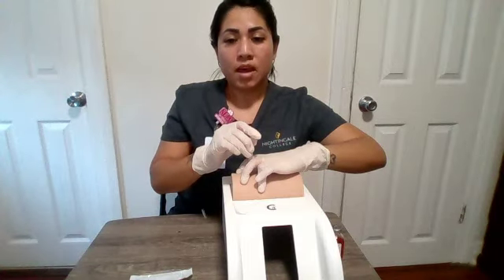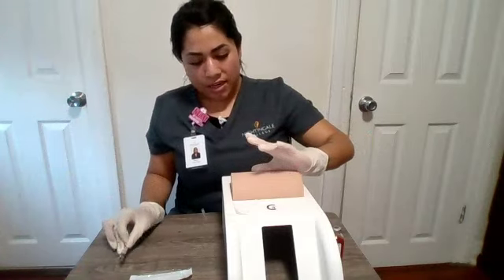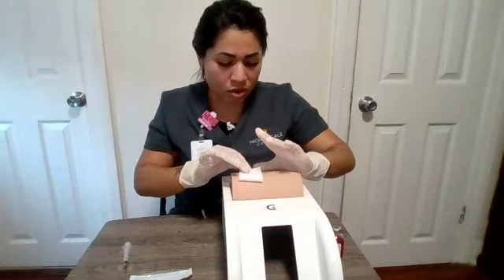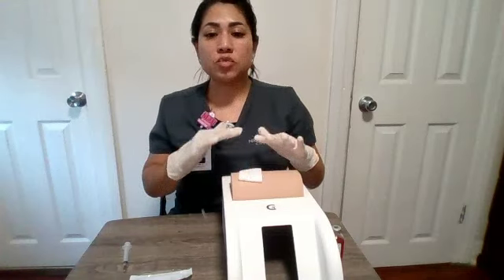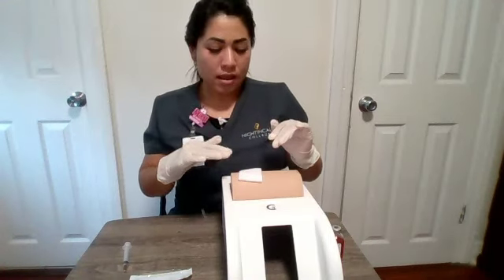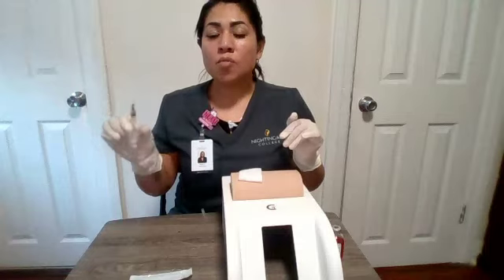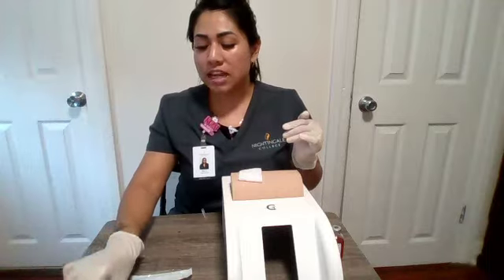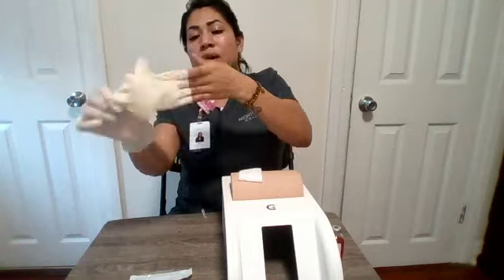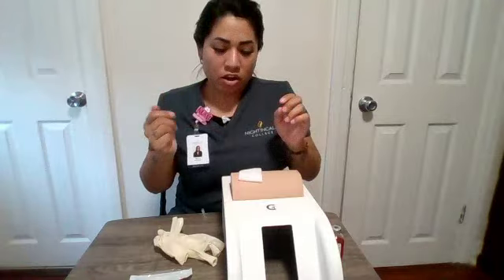Then I will release my patient's skin and place a gauze over the site. Apply gentle pressure, making sure that we do not massage the site, and then we will apply a bandage if it's necessary. Then I will make sure that I toss my needle and syringe inside of a sharps container, and I will remove my gloves, perform hand hygiene, and I will document the procedure.